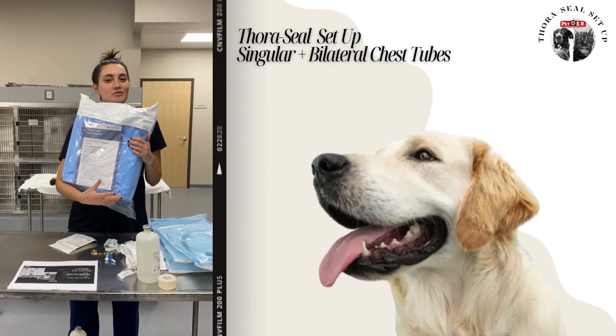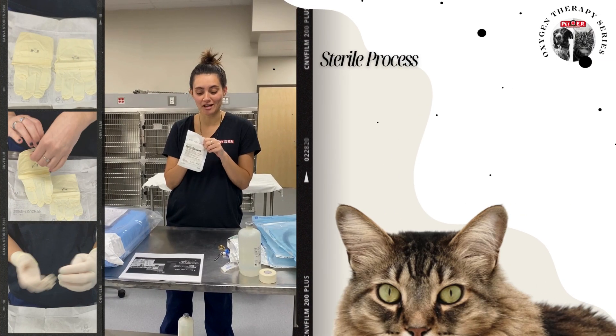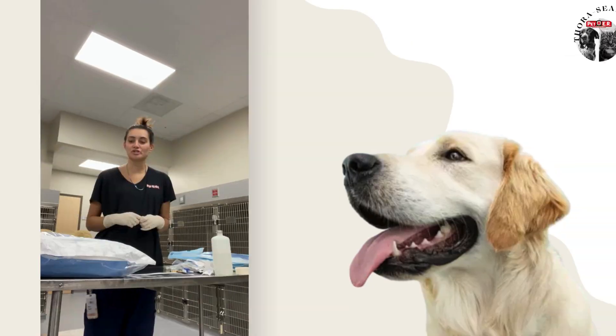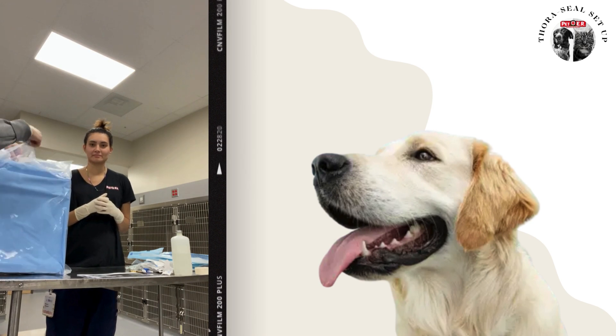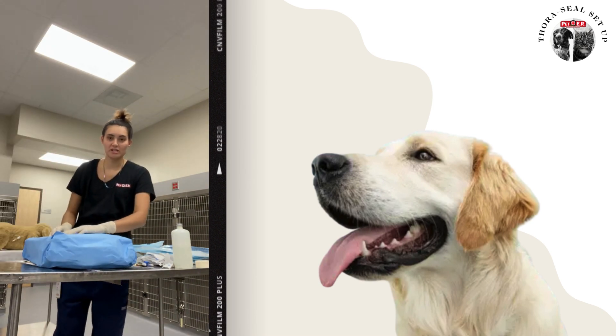We're going to go over how to set up the Thoraseal for when we have chest tubes and continue with suction. First, you're going to put on your sterile gloves. Your buddy is going to open the Thoraseal package for you sterilely, and then you're going to open it thoroughly.